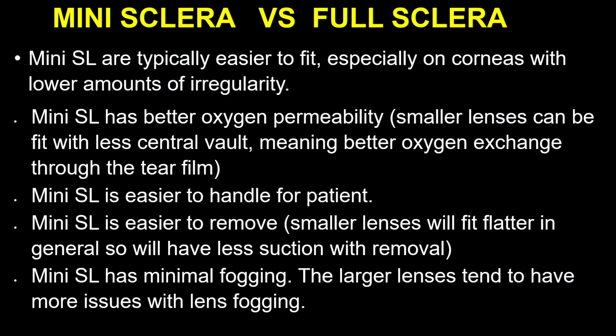In terms of fitting, this is a very interesting part of it. In terms of fitting, the smaller the diameter, the easier the fitting. I remember what Dr. Osazee mentioned when he was responding to the initial question I asked, the interaction we had before. One challenge people have with fitting scleral contact lenses is the size. Remember, an RGP is just a small contact lens that you can hold with one finger and put on the cornea. In the case of the scleral contact lens, the size makes it a bit more difficult to fit. And the larger the size, the more difficult it is to fit.